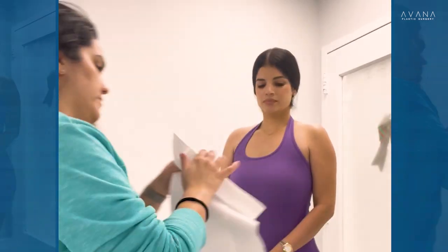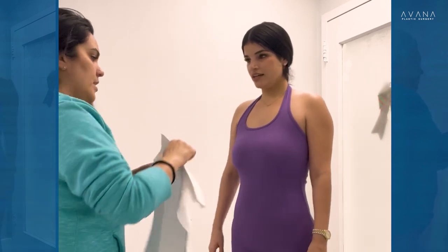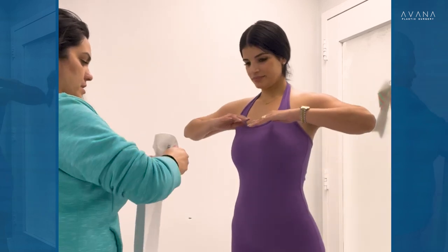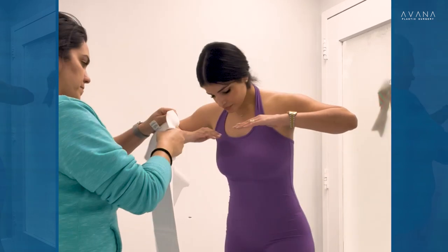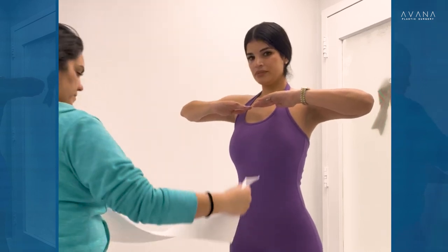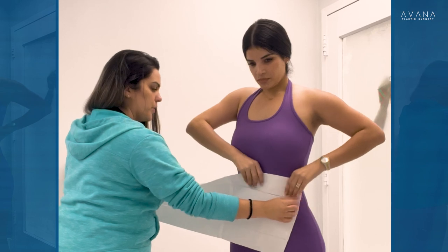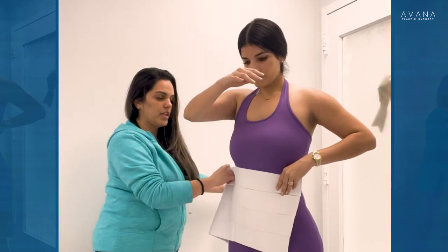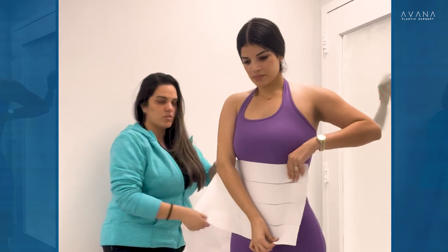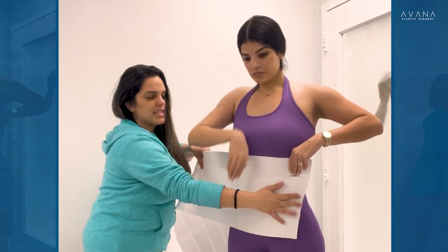This side goes on your abdomen like this, and your legs separate. This side goes on your belly — you hold it with one hand. You are going to need someone to help you the first three days because you will not be feeling good.